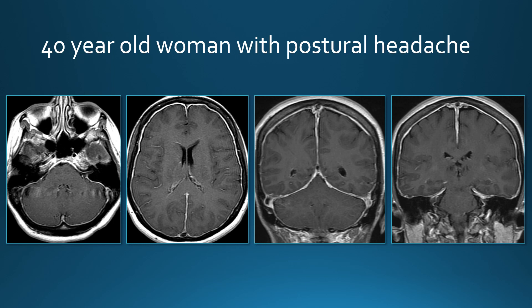A 40-year-old woman with postural headache. This patient does not have leptomeningeal enhancement — this is pachymeningeal enhancement. It's a very uniform pachymeningeal enhancement all around the skull and along the falx and tentorium. This very uniform, diffuse pachymeningeal enhancement is very typical for intracranial hypotension.